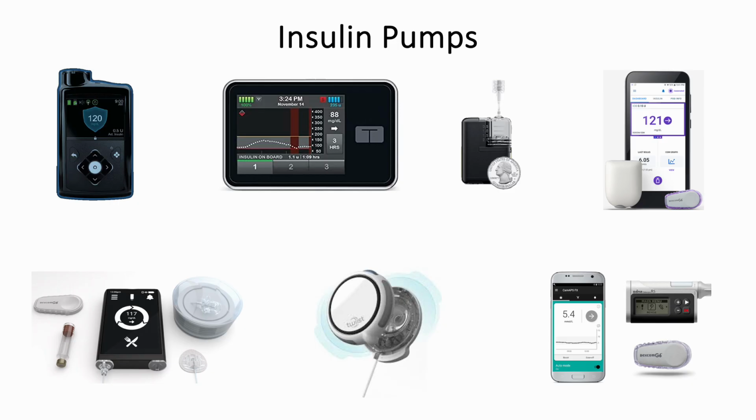So it's super, super important for you to be aware that as soon as the insulin pump comes off, or if you're going to take it off, you have to give them basal insulin. Be aware that there are going to be some new order sets coming out that we're going to use for insulin pumps, that if we're going to discontinue an insulin pump, basal insulin must be ordered. So just be aware of that.